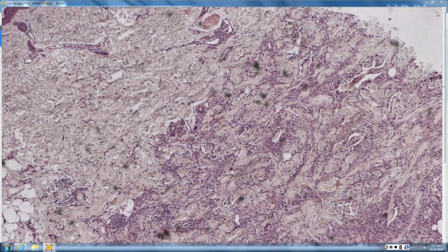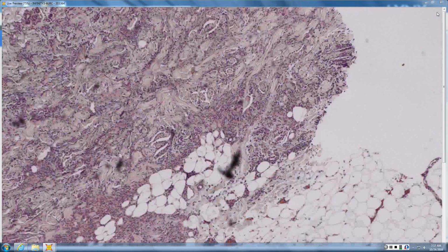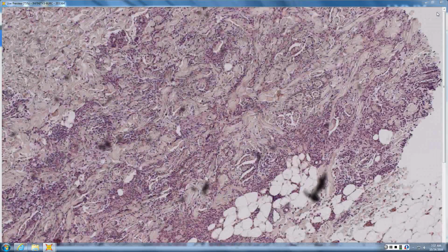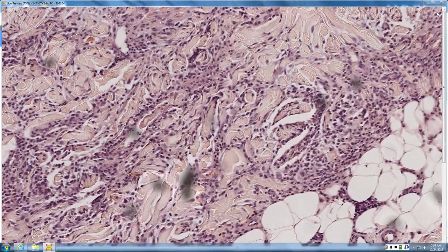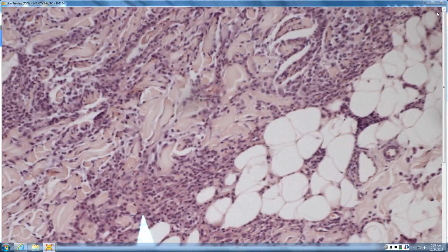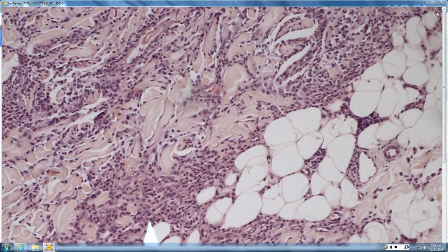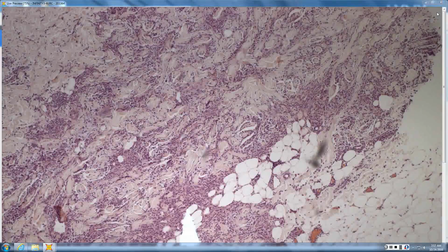So, infiltrate down deeper, and it is all histiocytic. And the way you know it's histiocytic is if you go on higher power, there's cytoplasm, and there's no collagen between the cytoplasm. So it's cell upon cell, cytoplasm upon cytoplasm. That's what defines histiocytic granuloma. Right? And the pattern of that is linear, palisaded, or interstitial trapping collagen.